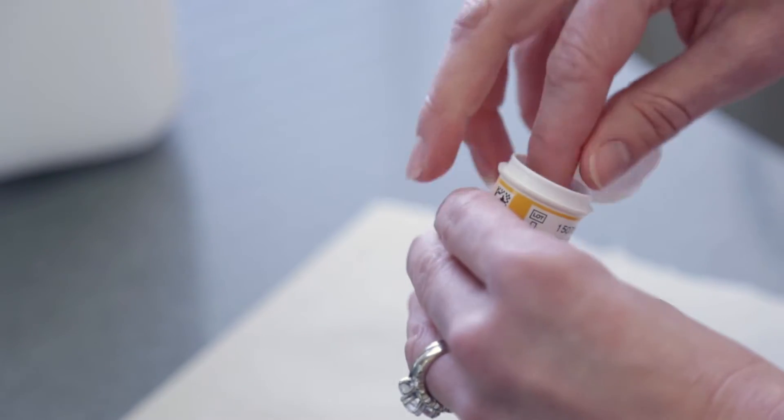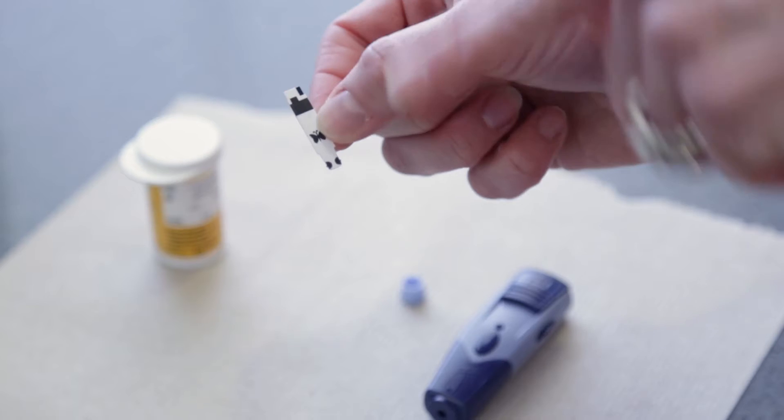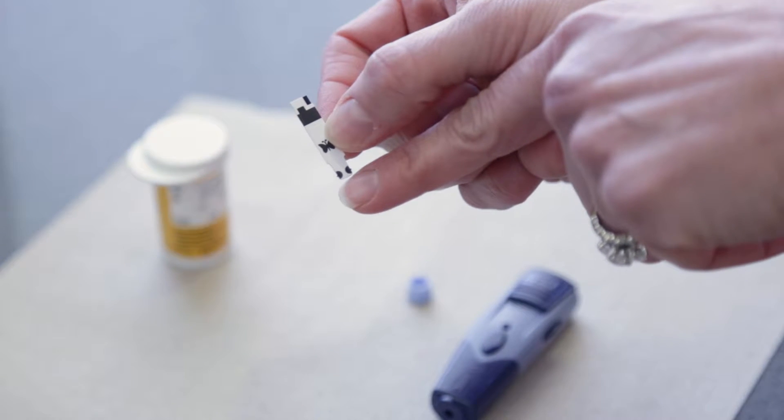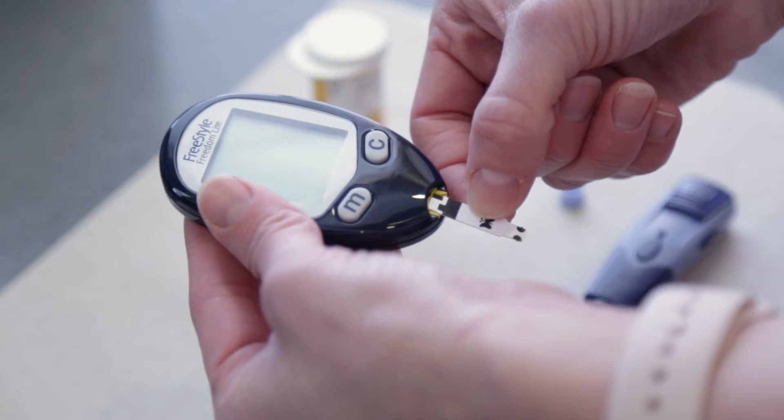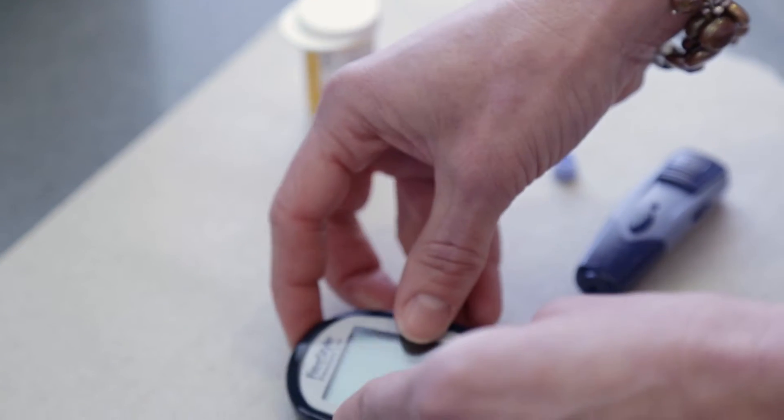Next, remove the test strip from the bottle. Your test strip will have two ends: one end inserts into the meter and one end collects the blood sample. Insert this end into the meter. The meter will turn on automatically once the test strip is inserted.